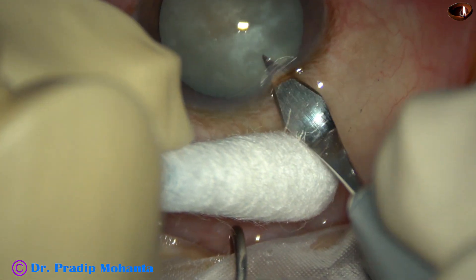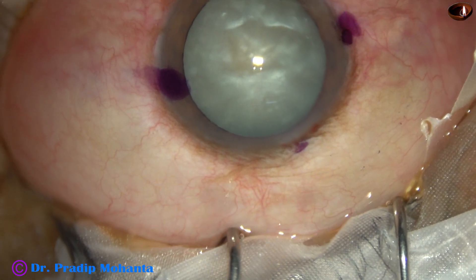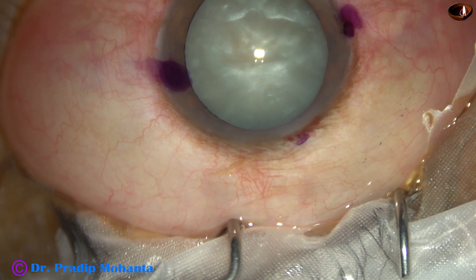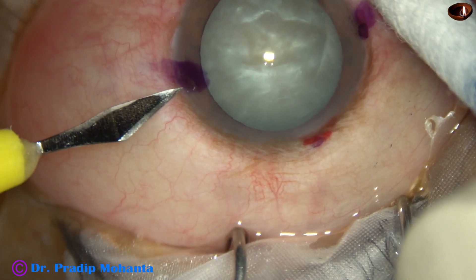This is an intumescent cataract. The main challenge in this case is capsulorhexis. Otherwise, the cataract doesn't appear hard, though it is white and mature.